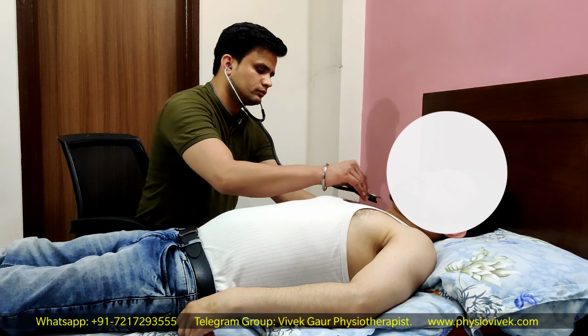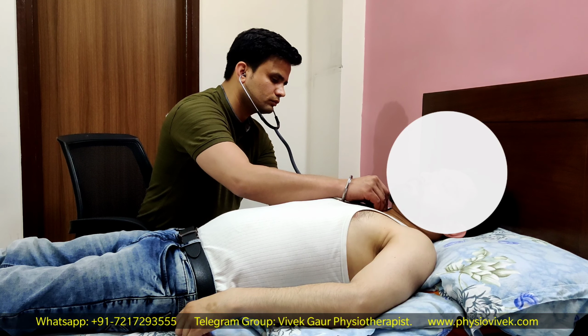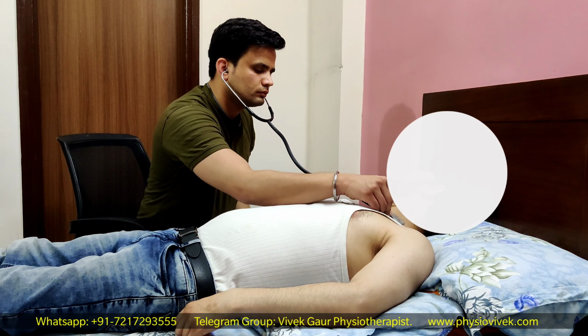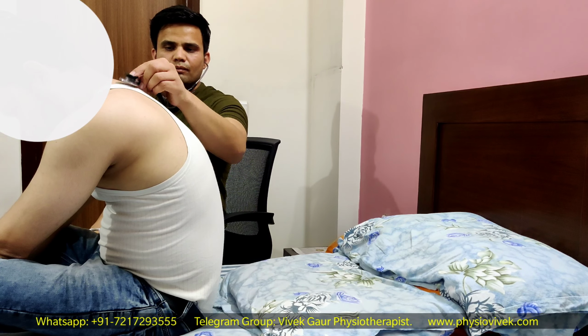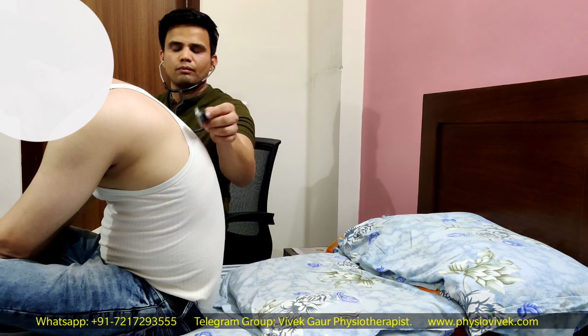Now move the bell of the stethoscope right over the carotid area on the right and respectively on the left side, and listen for the heart sounds again. If there is a murmur of aortic stenosis, it can also be heard on the carotid arteries in your neck. Now ask the patient to sit and hunch forward and place the diaphragm of your stethoscope on his back and listen for any heart sound that might be coming over there as well.